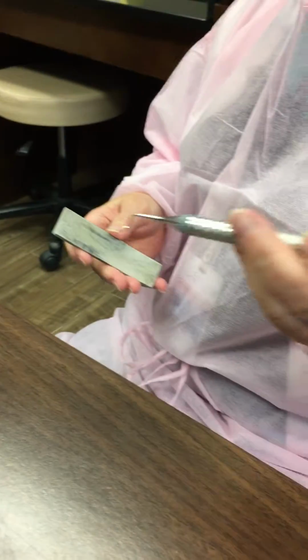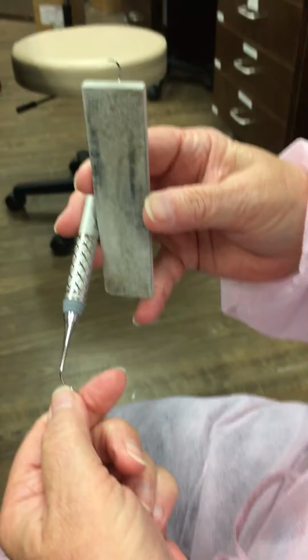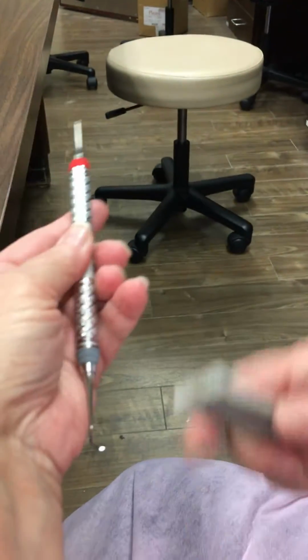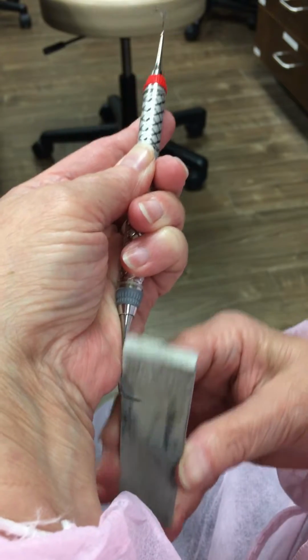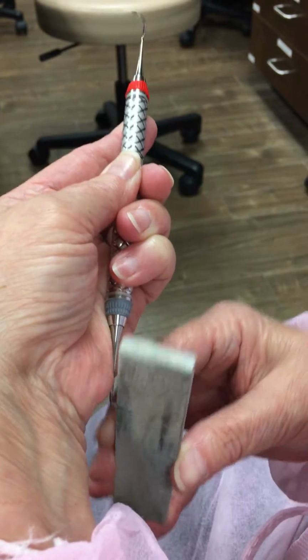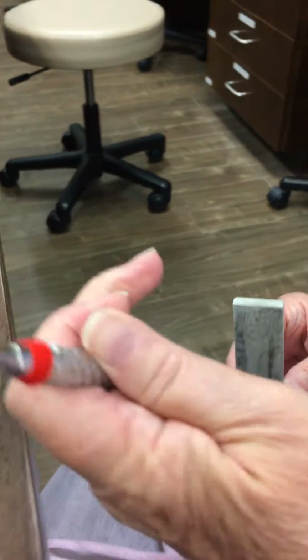Now I have the Nevi 2, which is another posterior instrument, same thing. You want to look for the lower third of the shank, so that means your handle is going to be tilted away from you. I've got my toe toward me. Start at the back, 90, 110, 90, 110. And the sharper that your instrument is when you start to sharpen it, the quicker you will achieve sludge on your blade. I'm going to turn it away now.